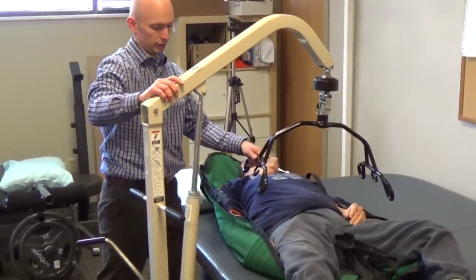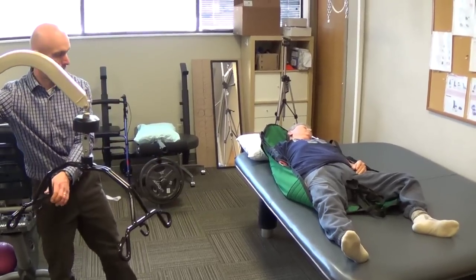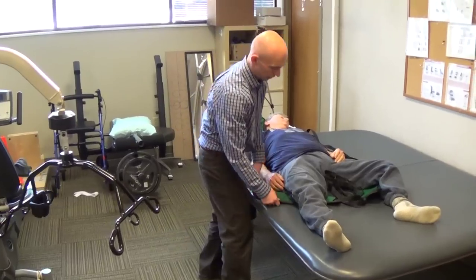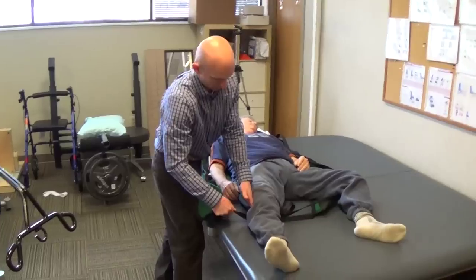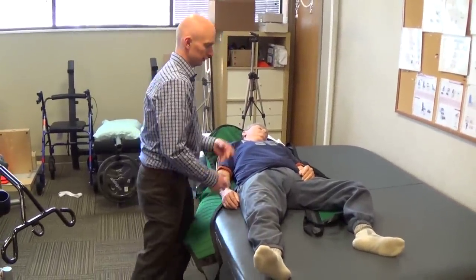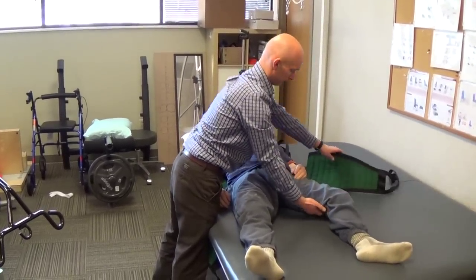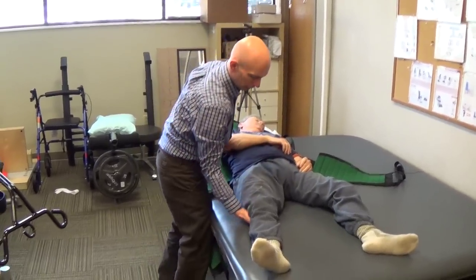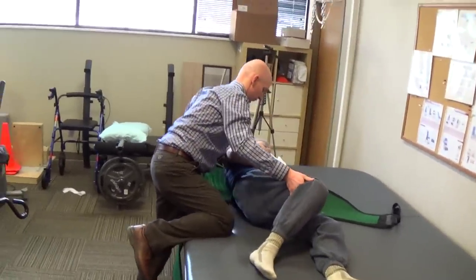Unhooking the straps and then moving the lift away. To remove the sling, just slide the leg straps out from underneath the person's legs. Moving an arm, helping them bend the leg. Turn to the side.